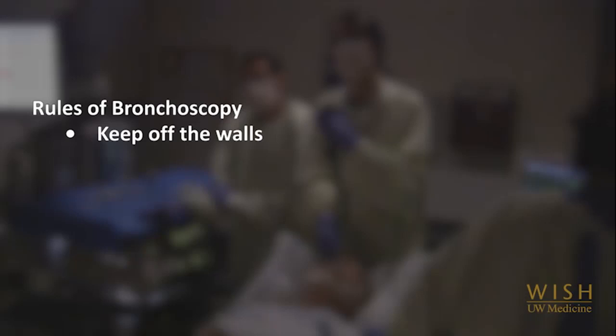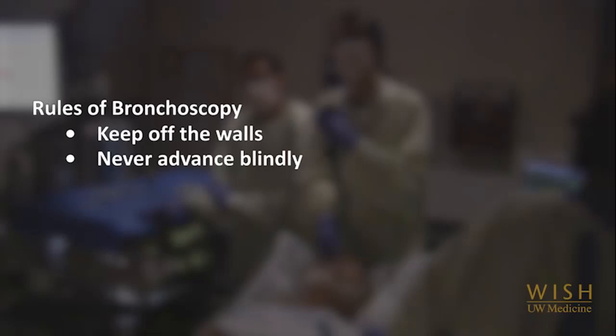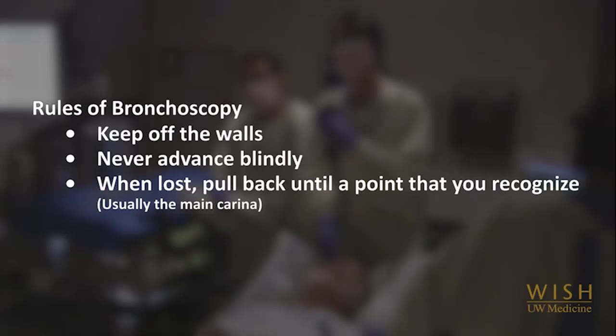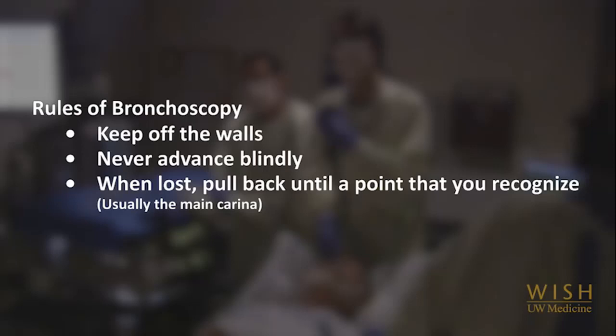Try to clear the tip of the bronchoscope with gentle suction or by instilling 3-5ml of saline through the suction channel. You can also try to wipe the tip of the bronchoscope on the wall of the trachea. If you still cannot see or do not know where you are in the airways, pull back until you reach a point that you recognise. This is usually the main carina. Avoid pulling back too far — you don't want to have to go through the cords again. Some providers measure the distance to the mid-trachea on entry as a reference point.